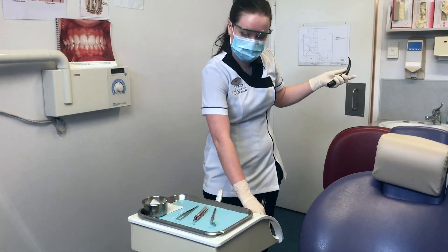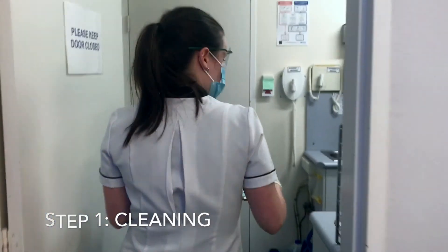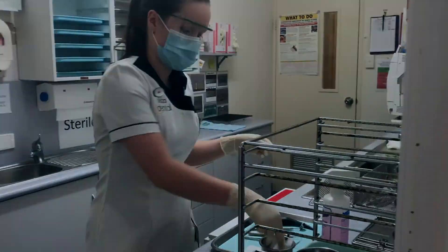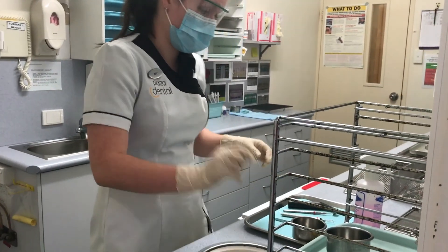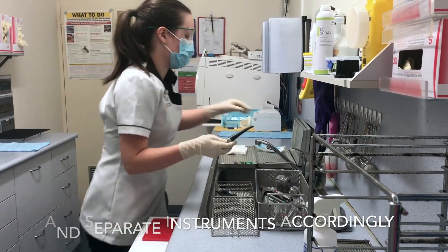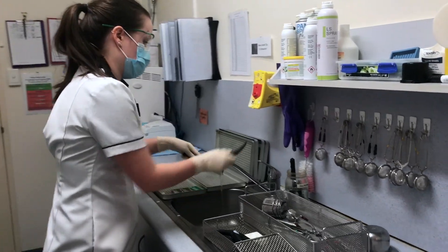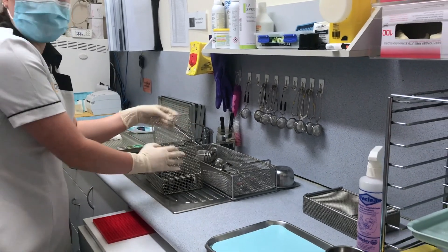Today we're watching Bec disassemble everything and take a dirty tray into our clean-up room. This is the process and the steps that we follow. First off, we always get rid of our rubbish, pop our instruments — once they're looking clean — into our thermal disinfectant trays. We always make sure we give our triplexers a scrub, and then straight into the basket, ready to go on.